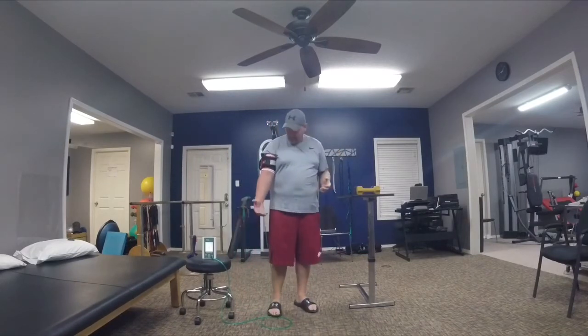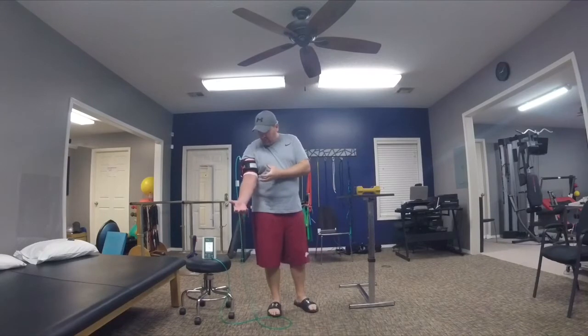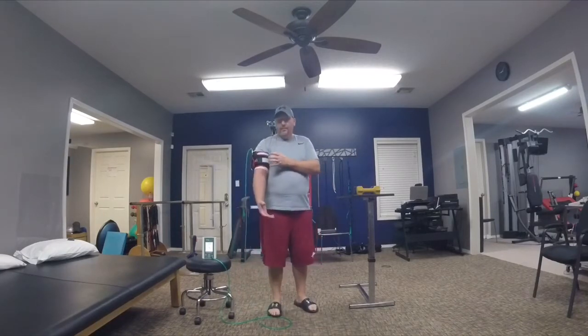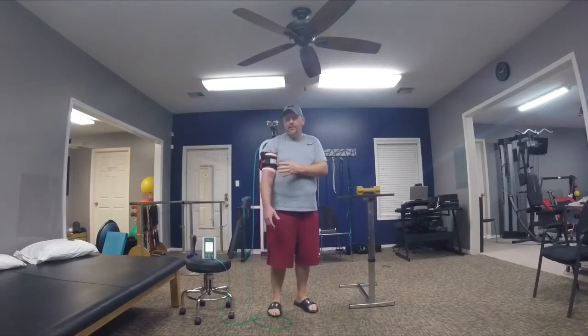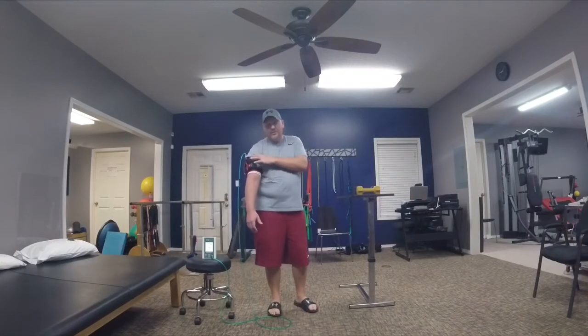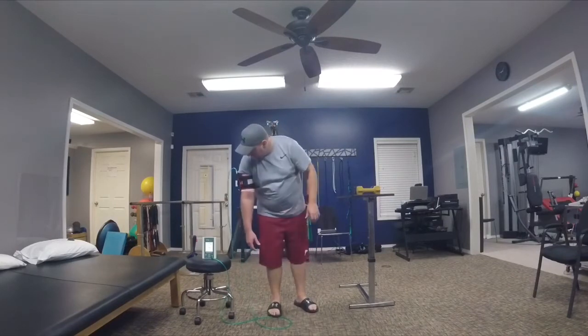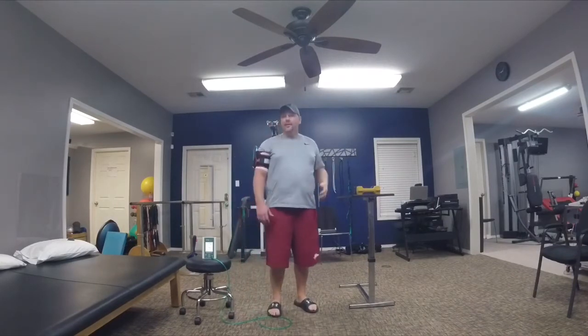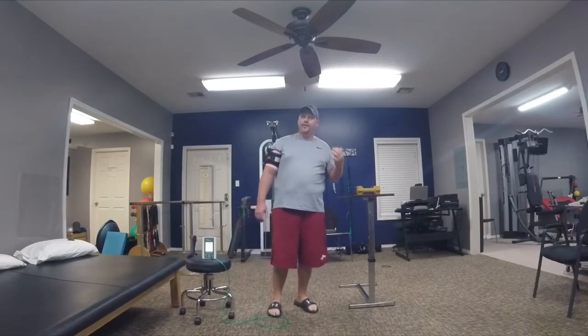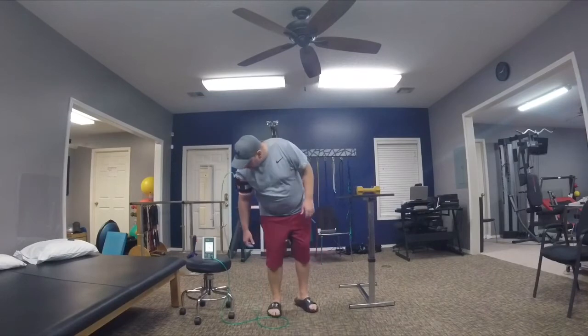So already I'm feeling that huge muscle pump. My arm is becoming hypoxic right now. It is not letting oxygen past this point. So from here on out, I should be really forming a lot of lactic acid, which will stimulate my brain to produce more growth hormone.